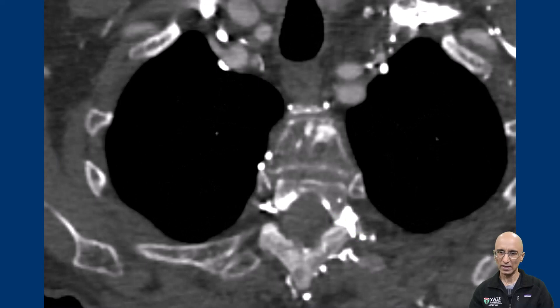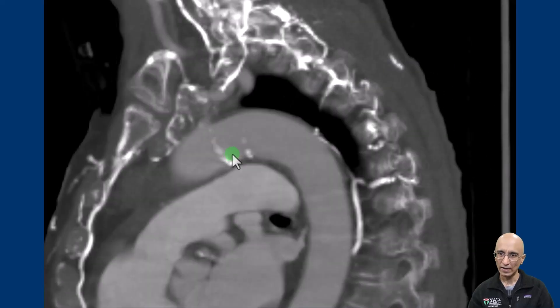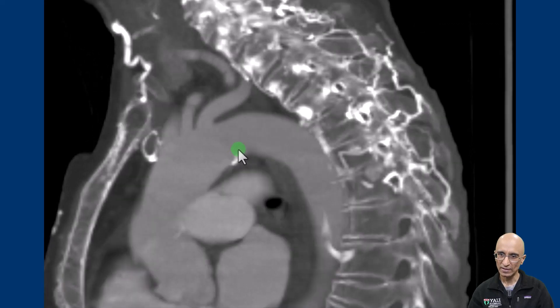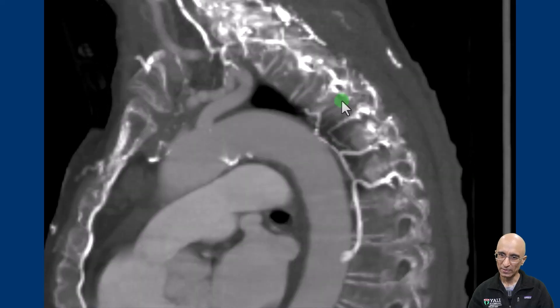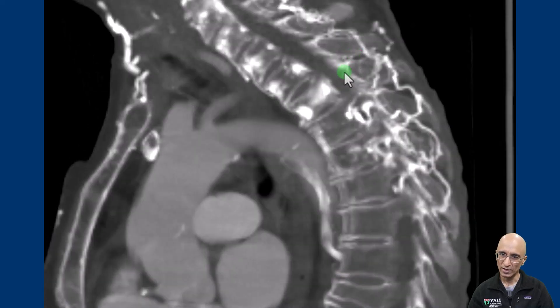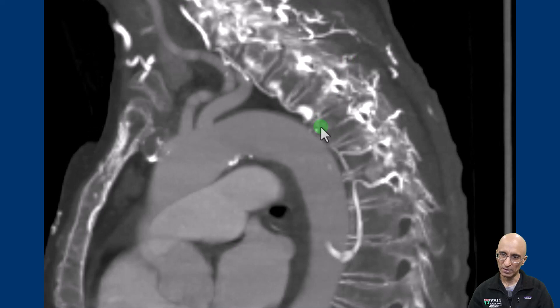On the post-contrast sagittal images, as I window through, we can see multiple collateral vessels both anterior to the vertebral bodies, within the vertebral bodies, in the spinal canal, and along the posterior aspect of the vertebral bodies.